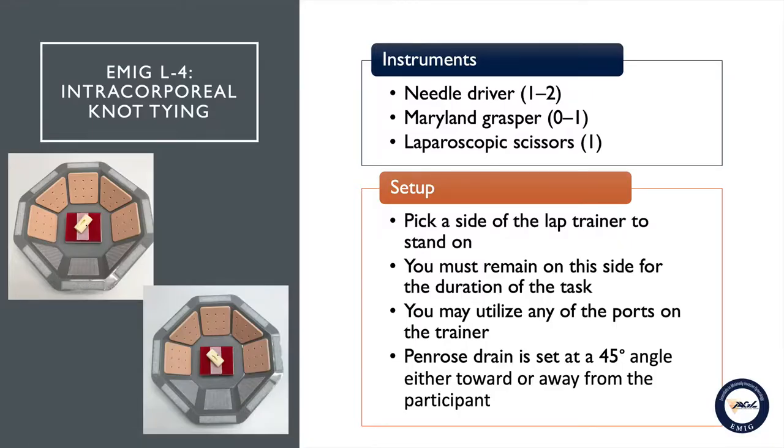EMIG task number four: intracorporeal knot tying. To perform this task you will be provided with two laparoscopic needle drivers. You will also be provided with one Maryland grasper to use in place of one of the needle drivers if you choose, and you will also be provided with one pair of laparoscopic scissors.